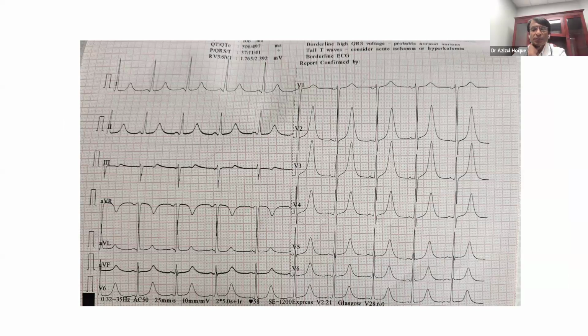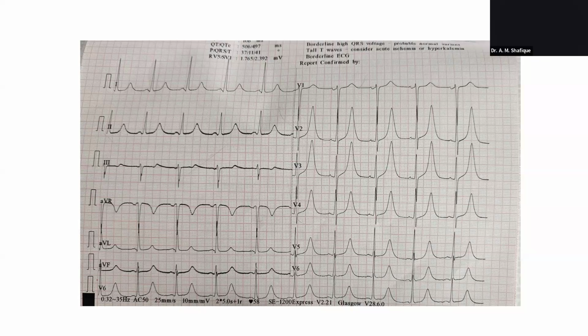And another question is, is the patient having any symptoms? Actually, the patient is on ventilator, and decompressive craniotomy was done because of intracranial hemorrhage. Patient is female, on antihypertensive medication, including IV GTN. NT-proBNP was higher.